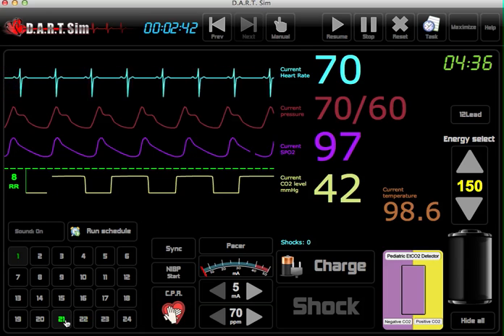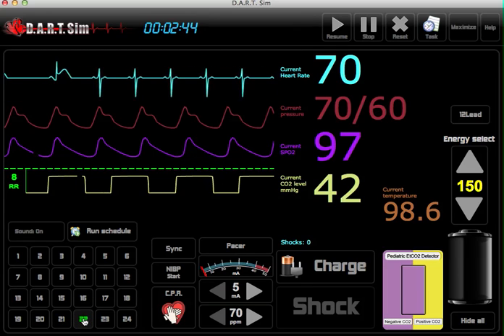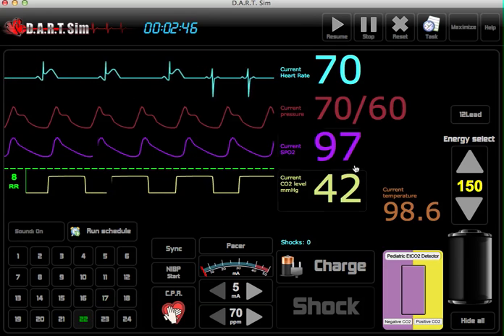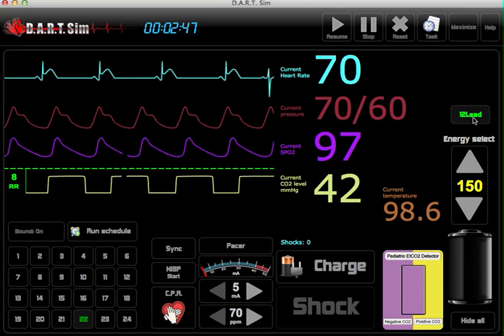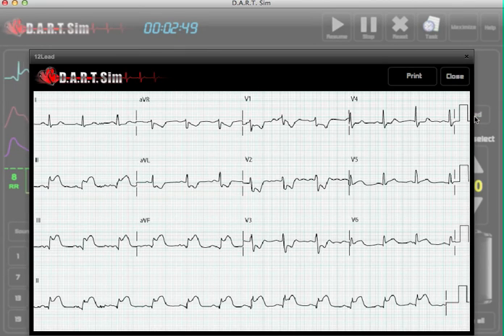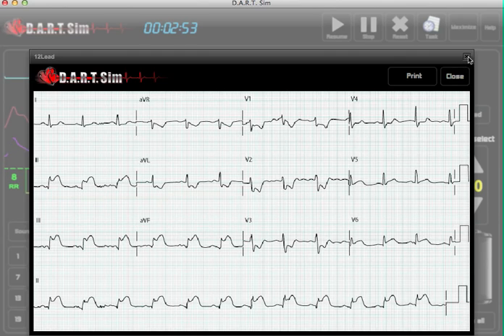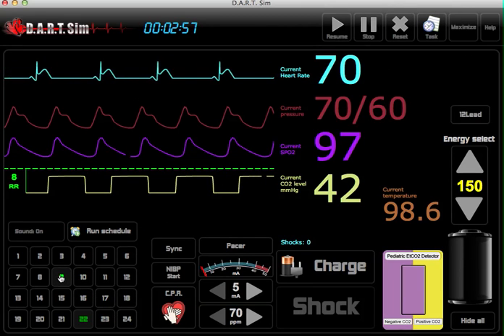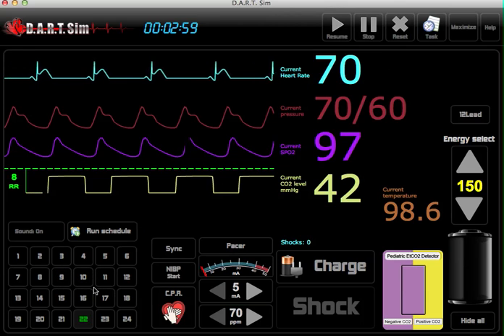At any time you can also change the rhythm manually. And also you can get a 12-lead on all rhythms that we have displayed — so we have 24 different 12-leads that will be displayed on whatever rhythm you decide to choose.